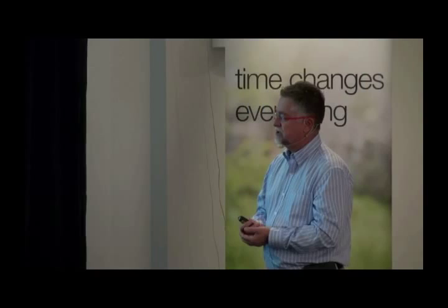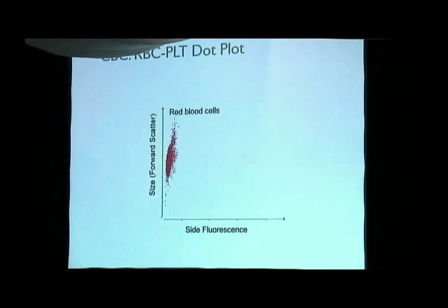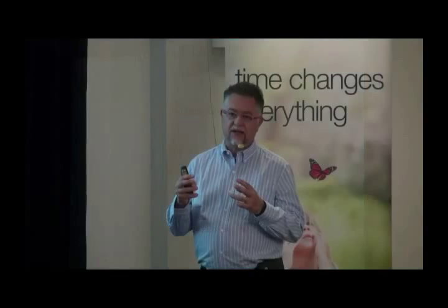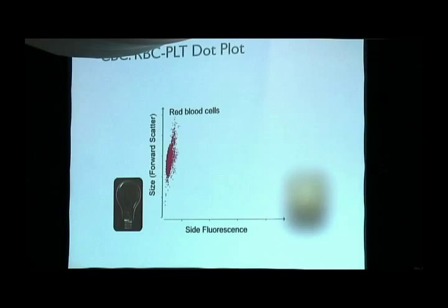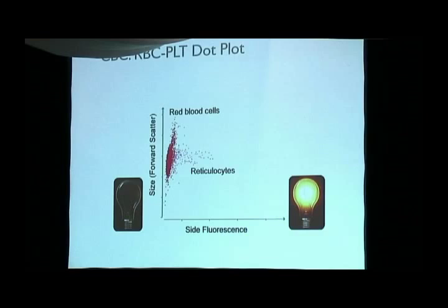What we're looking at on the horizontal axis is fluorescence. There is a fluorescent dye in the reagents, and remember, red cells do not have any RNA in the cytoplasm, but reticulocytes do. That is why they're called reticulocytes: with new methylene blue, they stain blue. Fluorescence means what's on the right glows a lot, and what's on the left doesn't glow as much. Each one of those dots is a reticulocyte.